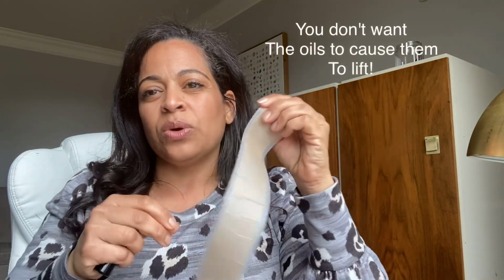And so I still tell people, when you have the silicone on, don't run over the edges of it because you don't want to lose it, but around, just go ahead and roll around and still keep using the oils that you have, so that you're also supporting the healing that's going on under it, okay? Then, after 3 to however many days I can keep them on, I take them off. I shower, and then I let them rest.